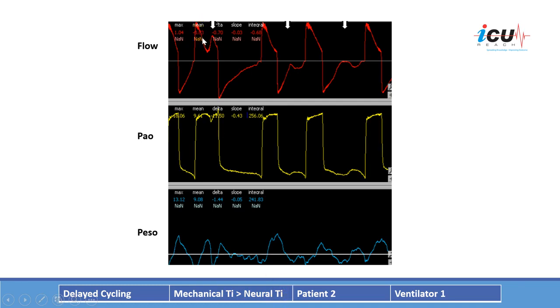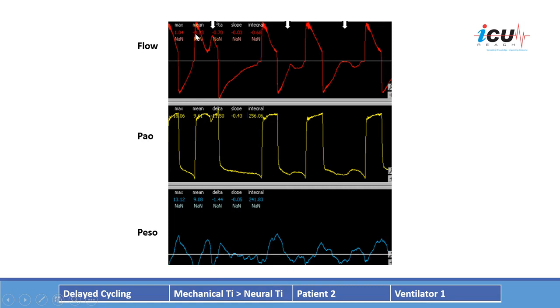The ventilator did not finish inspiration before the patient initiated another breath, ending up with two breaths from the patient and one breath from the ventilator. The second breath occurred while the ventilator was still delivering the first breath. This is delayed cycling: the inspiratory time on the ventilator is longer than the patient's inspiratory time, resulting in two patient breaths and one ventilator breath.